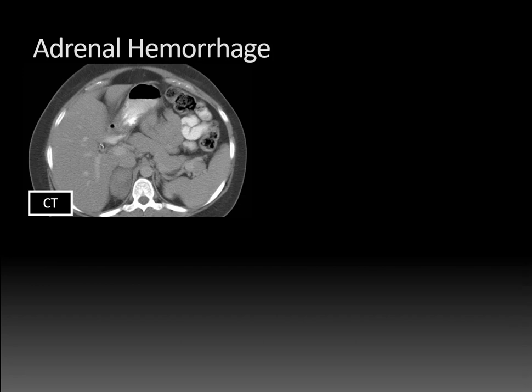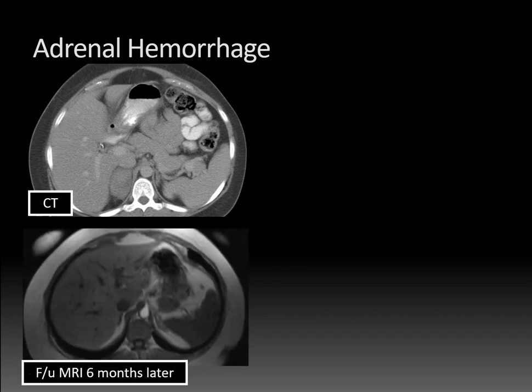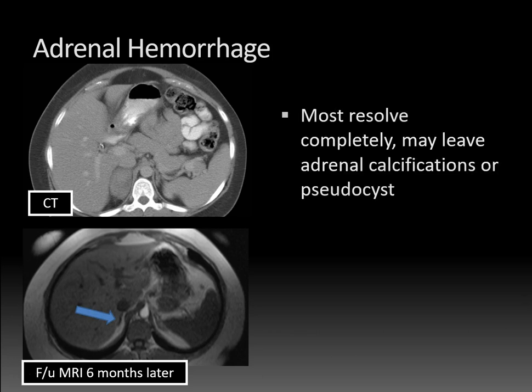What's usually the course for adrenal hemorrhage? This same patient had a follow-up MRI six months later, and you can see that the right adrenal gland posterior to the inferior vena cava looks totally normal now. In most cases, adrenal hemorrhage will resolve completely. It may leave behind adrenal calcifications or a pseudocyst, which I'll talk about in a later lecture.